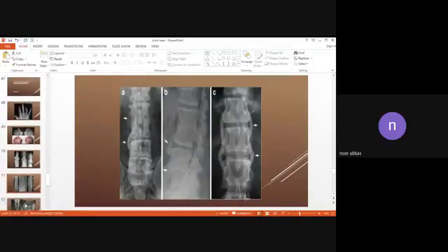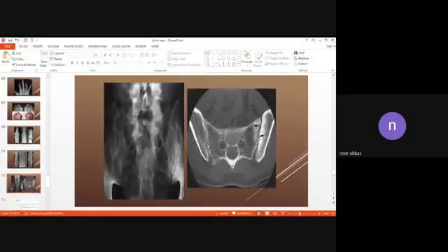In the spine, seronegative arthritis have tendencies to involve the sacroiliac joint and the interspinous ligaments. So in psoriasis, it will build up an ossified tissue, fusing the vertebral bodies. These are called syndesmophytes, so we have syndesmophyte formation. This is part of their new bone formation abilities, and in the sacroiliac joint, they will form a sacroiliitis. In psoriatic arthritis, the sacroiliitis is typically asymmetric, involving one joint more than the other.